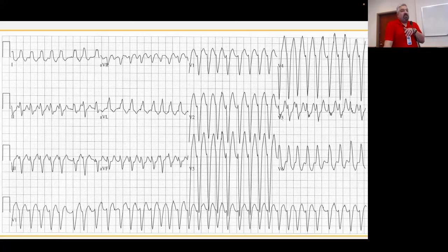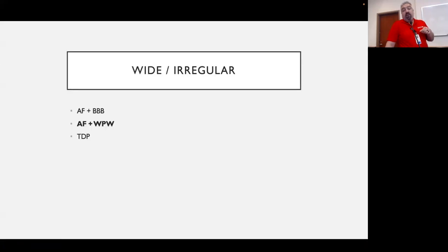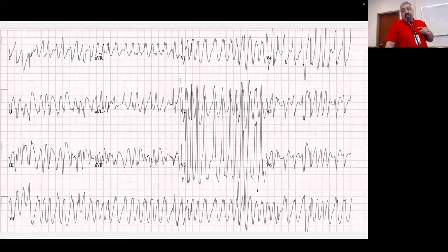Also, this patient is going to be stable, right? Because it's just AFib. Also, I really hope that you can find an identical looking bundle branch block on their previous EKG. Okay. So AFib with WPW, this is the one, right?